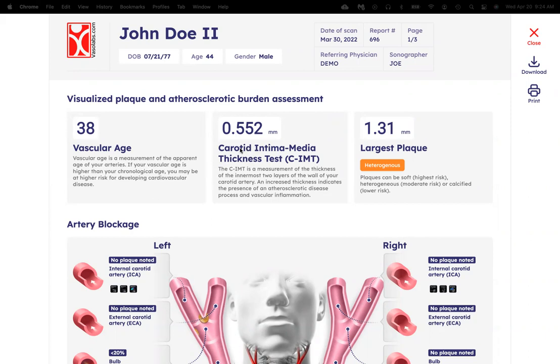This measurement is given in millimeters — you can see this one's 0.552 millimeters. If you have any plaque, that will be shown on the right with the size of your largest plaque and what kind of plaque it is.